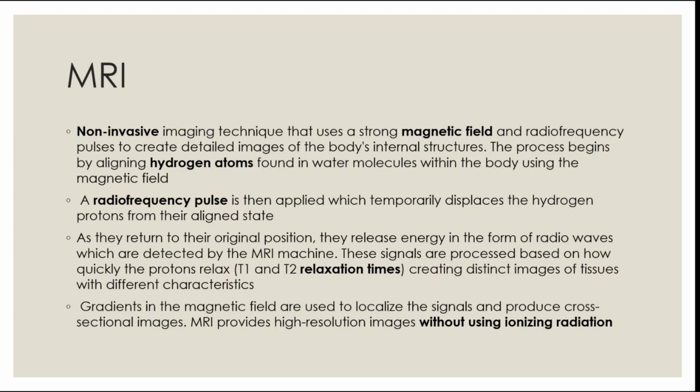But it could be used, most importantly in the brain tissue, but it could also be used sometimes in other organ systems, even though X-ray, ultrasound, and CT would do much better, but sometimes the results are inconclusive. So you need better imaging techniques, and that's where MRI comes in.